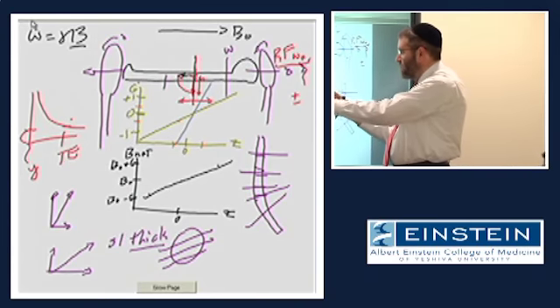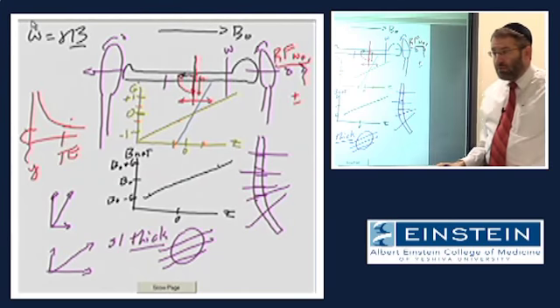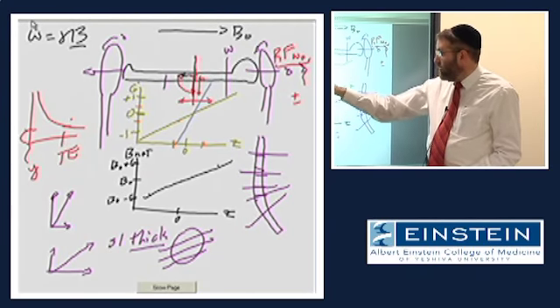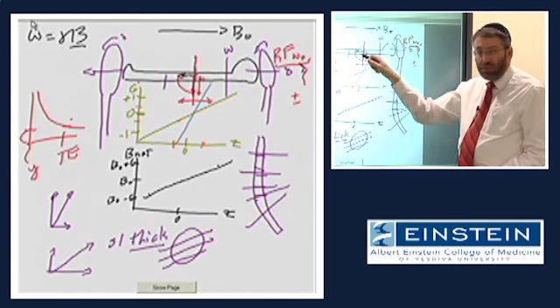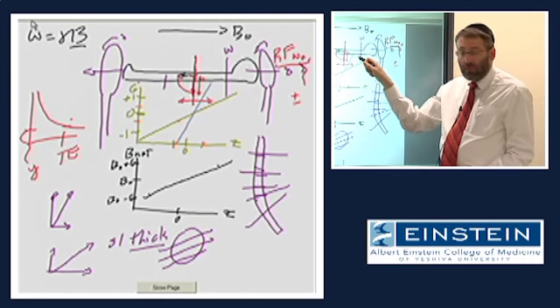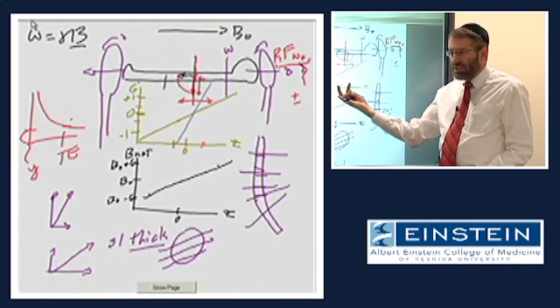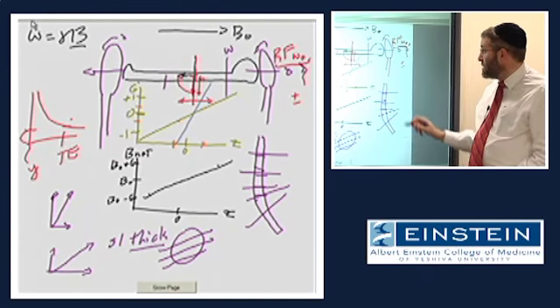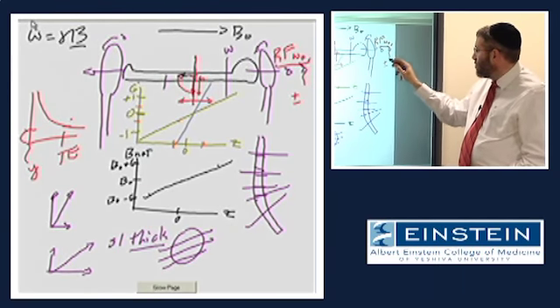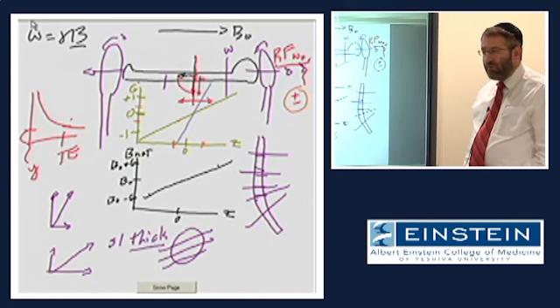The slice thickness will be demarcated by these little orange marks here, because the field strength corresponds to those locations in the scanner. Right? The spins within this swath of tissue are precessing at a given range of frequencies, which let's say is the range of frequencies at which we're transmitting our RF.